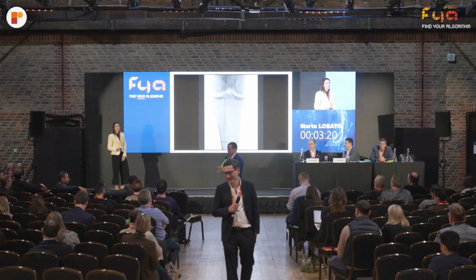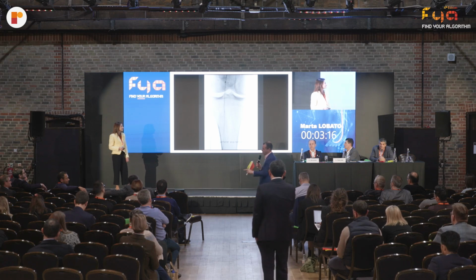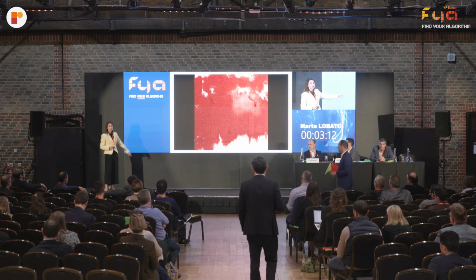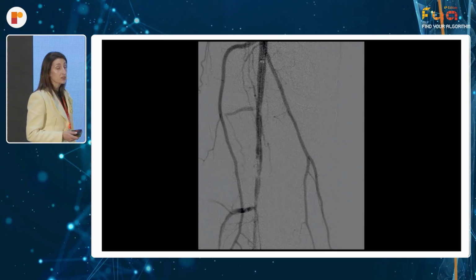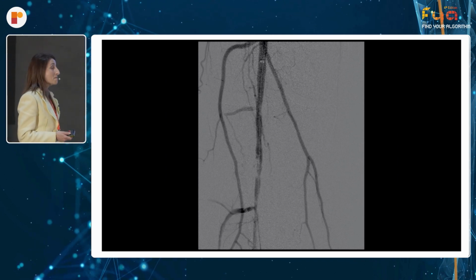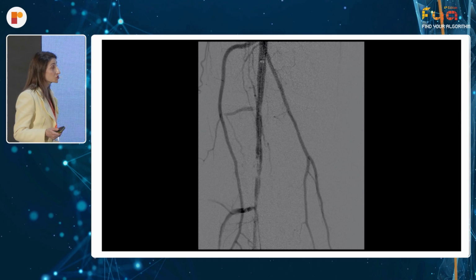And another thing that's important to understand, the clot starts moving down. This is where it becomes very, very nasty. So here you can see the aspiration, some clot, and this was the completion angio after the aspiration with the catheter. Not very nice, also the image. Maybe some residual thrombus, maybe dissection, not sure.